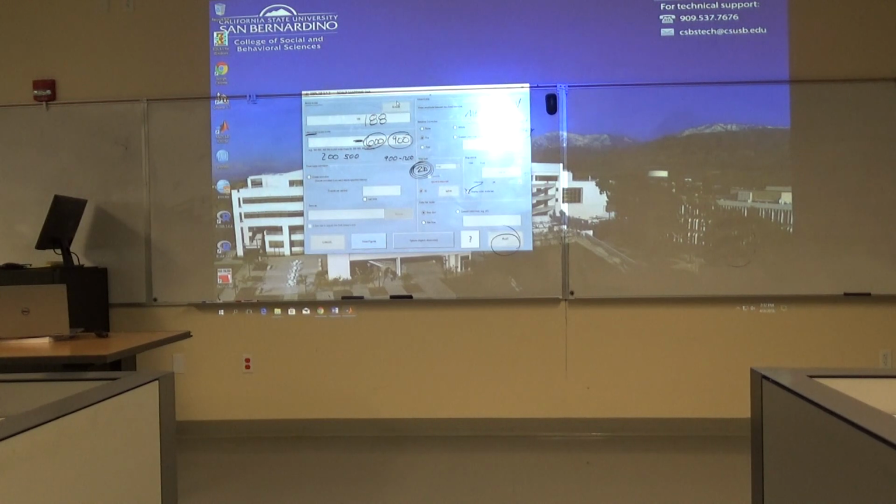But the bins just mean what condition. We'll get to this later in the class, because today I just want to show people around, play, and see what it's like. We're going to go into the nitty gritty for the next couple of weeks and months about actually analyzing other data to get here. But I want you to know what the fun spot is that we get to at the end, where we actually get to play with this stuff. The bins are basically the conditions, like you sort your socks, red socks, green socks, and put them in different bins. That's just a way to categorize your information. Is it working? Pretty cool, huh?